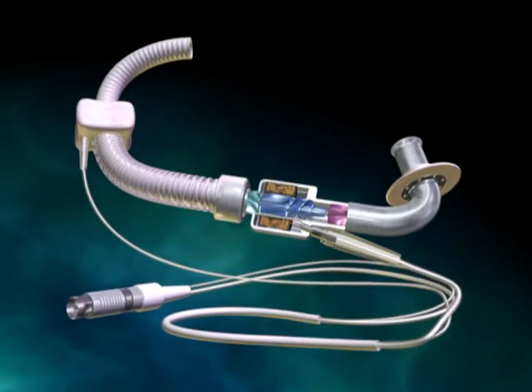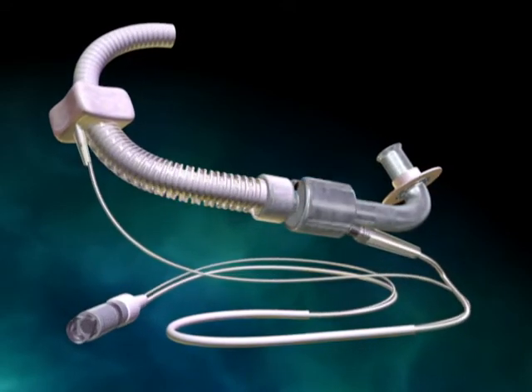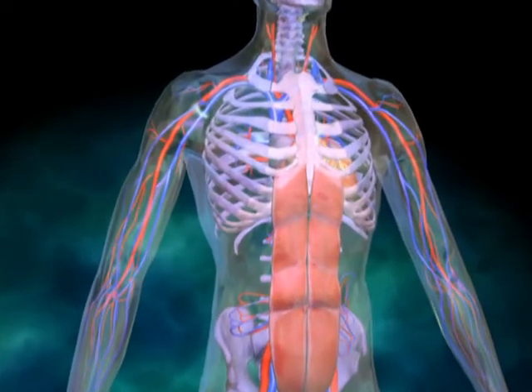Reliant Heart has developed a continuous axial flow rotary pump that can support and improve end-organ function in patients with heart failure.